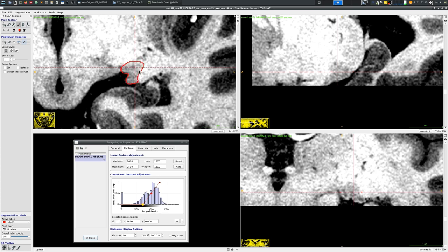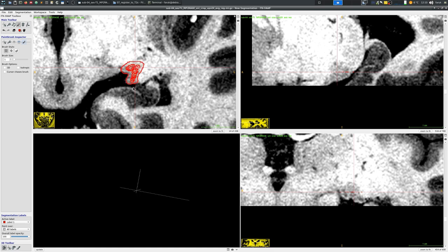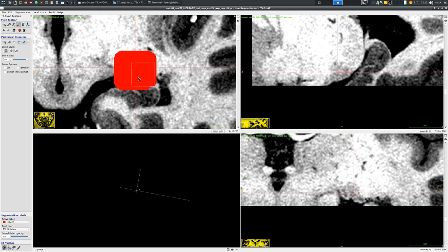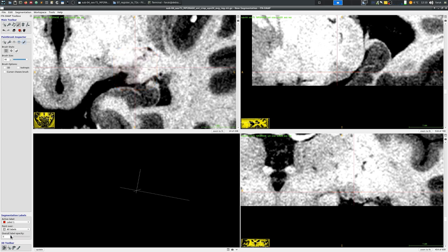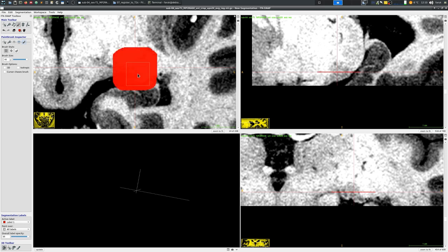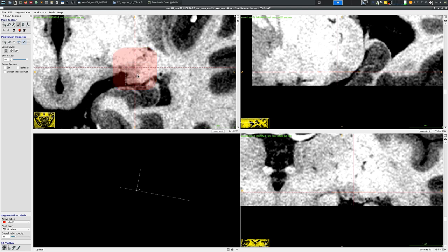These control the opacity options: one can toggle, the others can adjust. Here you can see that I made my brush size really large and then draw with it just to exemplify how the brush size works and now I am changing the opacity using my keyboard buttons.